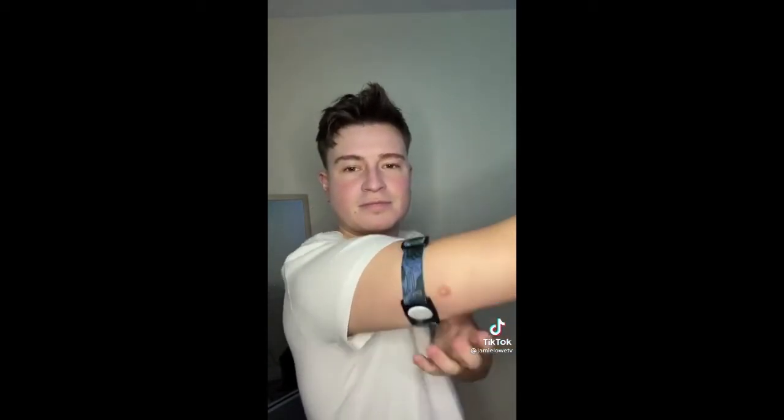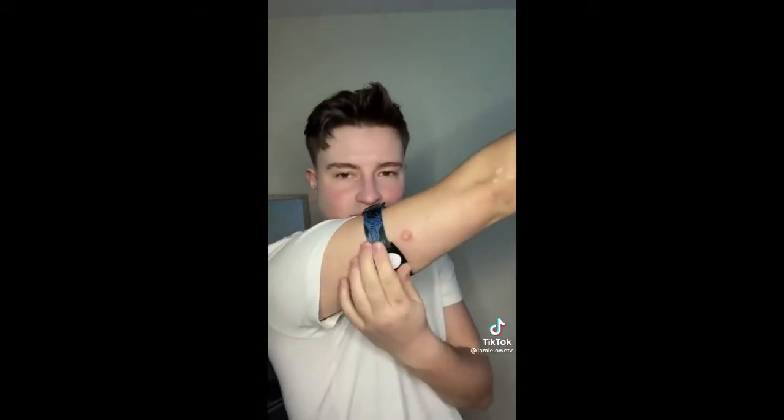Now this one is the Dyer style, and as you can see, I've got this really, really cool design. This one's really comfortable. I'm probably going to wear this one in bed, actually.